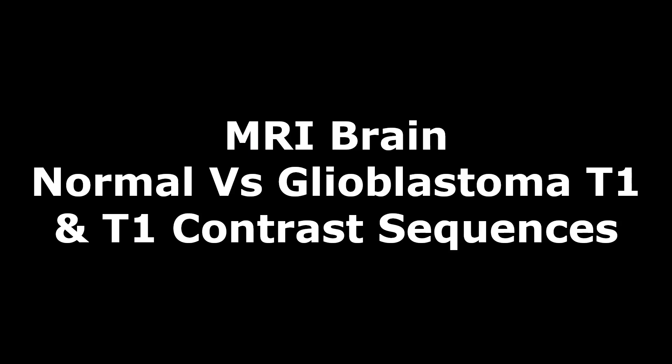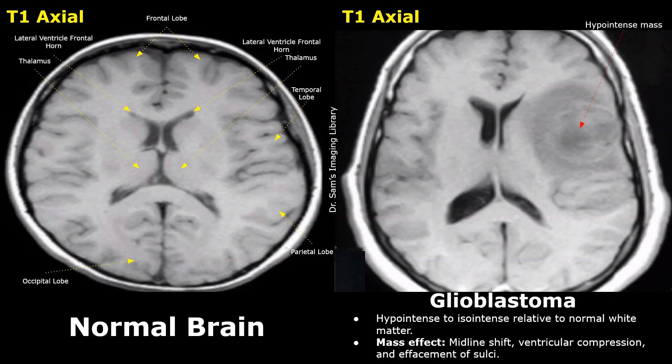Hello everyone, this is Dr. Sam and today we will learn about glioblastoma on MRI. We will only look at T1 and T1 contrast images. Glioblastoma is a WHO grade 4 astrocytoma, the most aggressive primary brain tumor. MRI is the key imaging modality for its diagnosis and characterization. Today, we will only focus on T1 and T1 contrast images of this tumor and study about other sequences in a separate video.